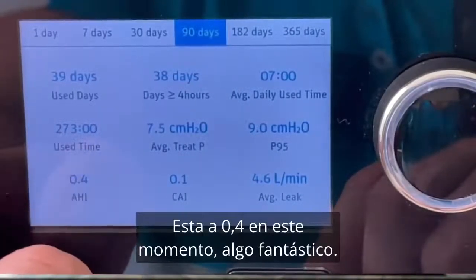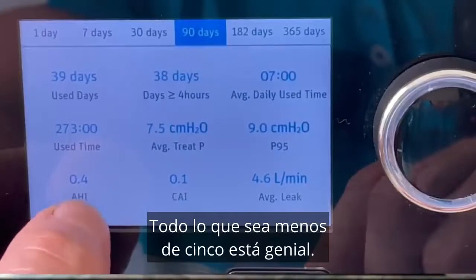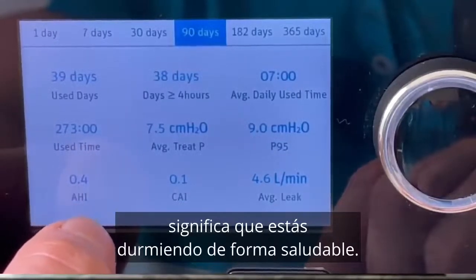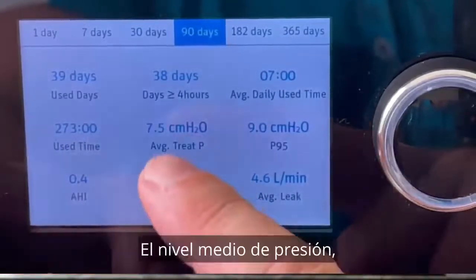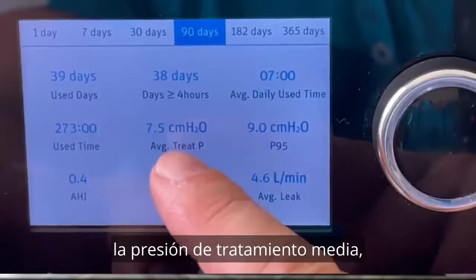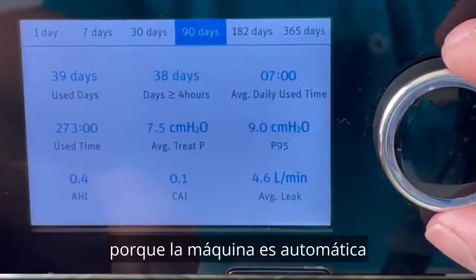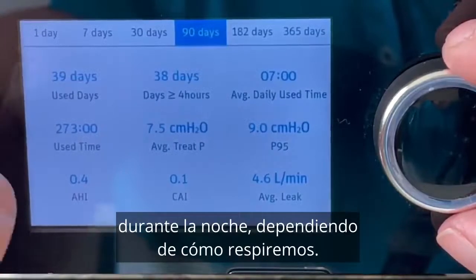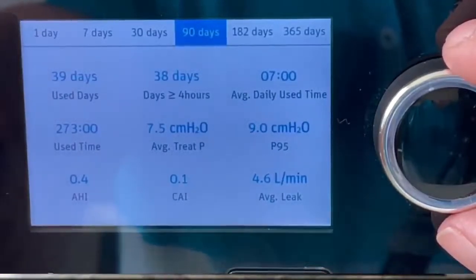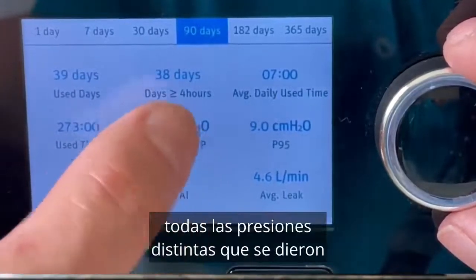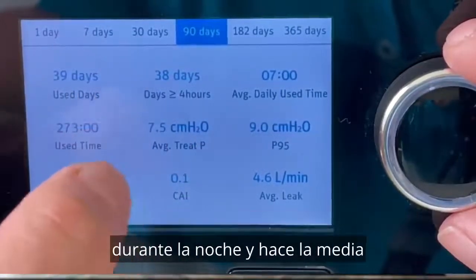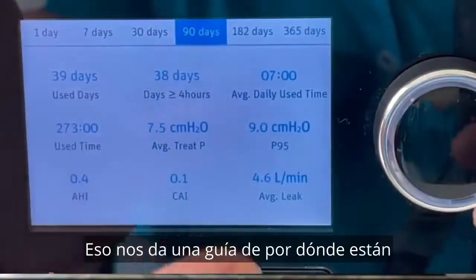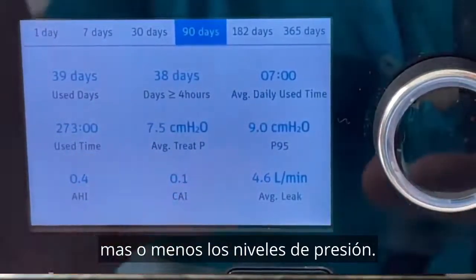The apnea hypopnea index is 0.4 at the moment, which is fantastic. Anything less than 5 is considered great, so if you can get that value to less than 5, it means you're getting a nice healthy sleep. The average treatment pressure — because this machine is an automatic machine that varies the pressure minute by minute throughout the night — is the average of all the different pressures provided during the night, giving us a guide as to where the pressure levels are.